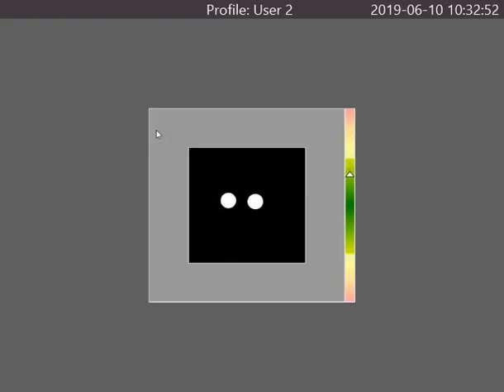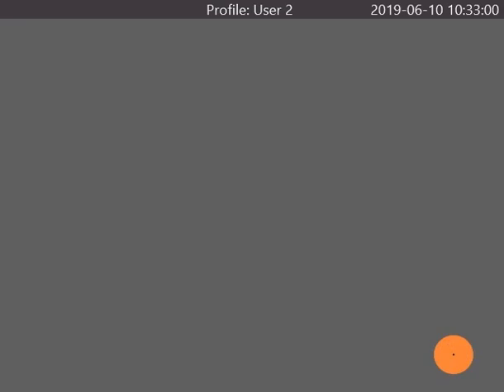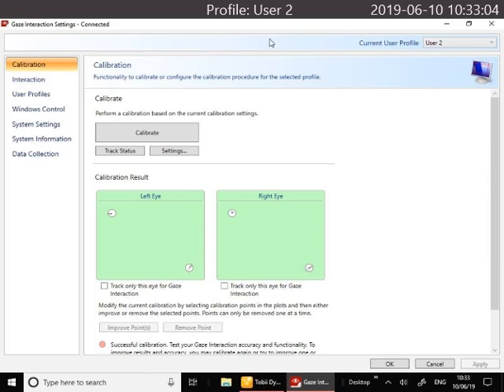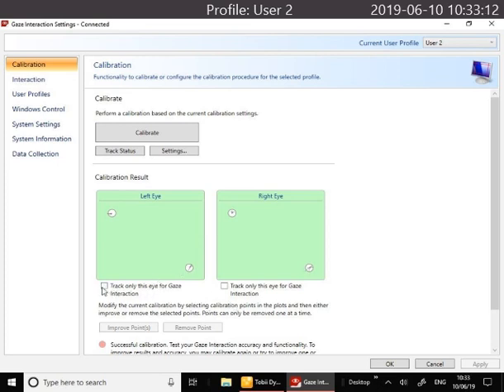Once you've completed the calibration you'll see the result. You can set up maybe the person's one eye is better than another, you might like to tell the software just to track only their left eye or only their right eye.